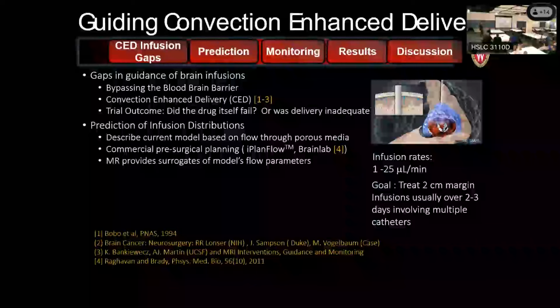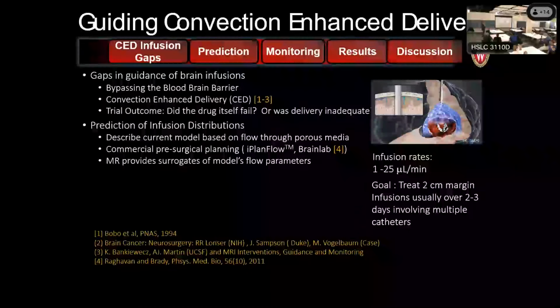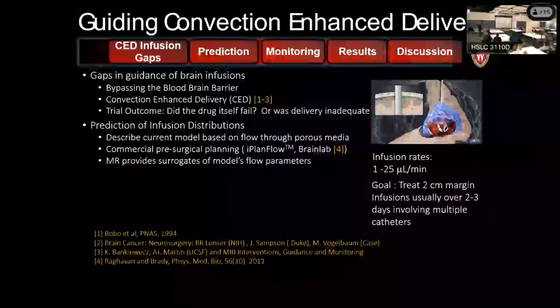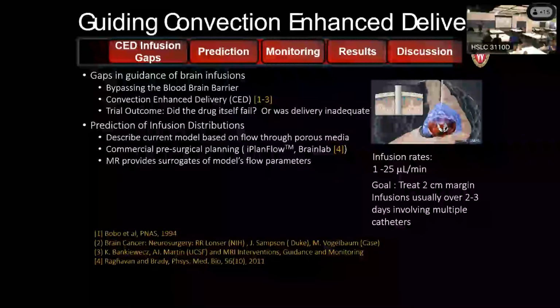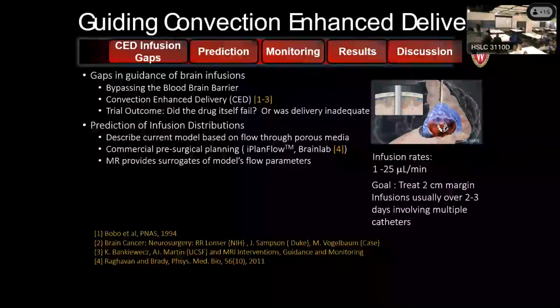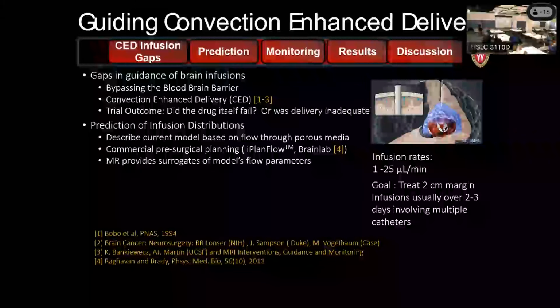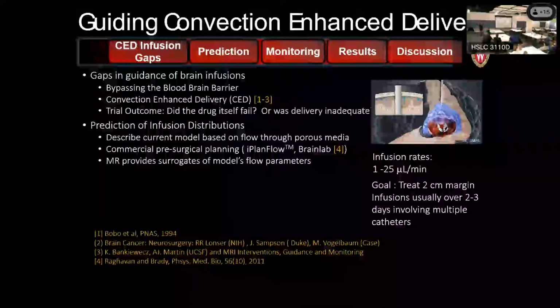There have been some exciting things now with ultrasound, being able to, with bubbles, disturb the tight junctions of capillaries. So you can deliver some chemotherapeutics systemically using those kinds of ideas. But this is when we are putting in a catheter; the catheters are on the order of 1 millimeter in size, the tips on the order of 1/10 of a millimeter.